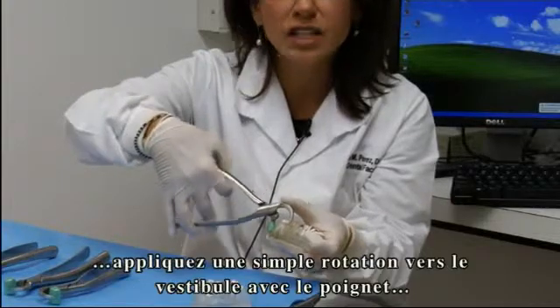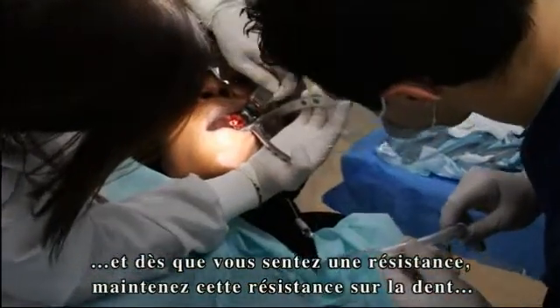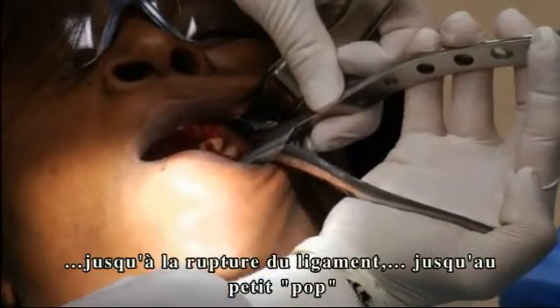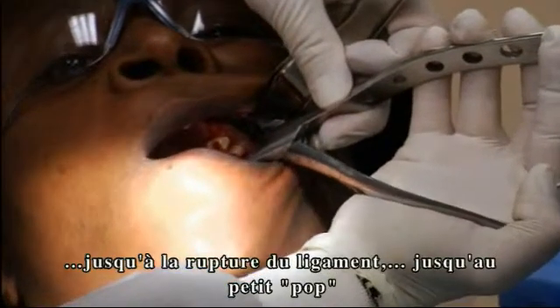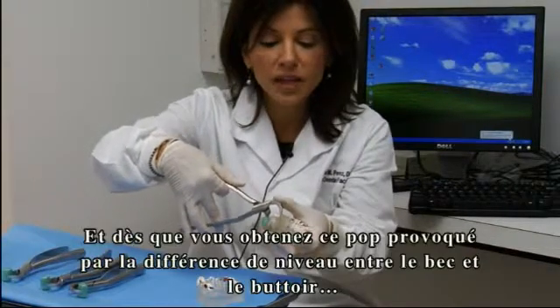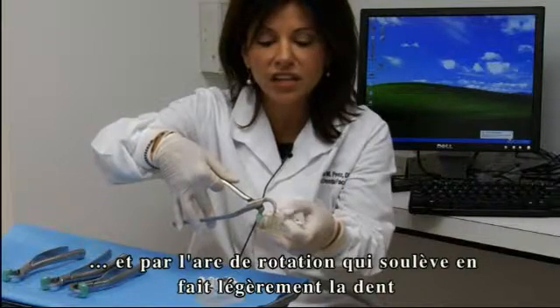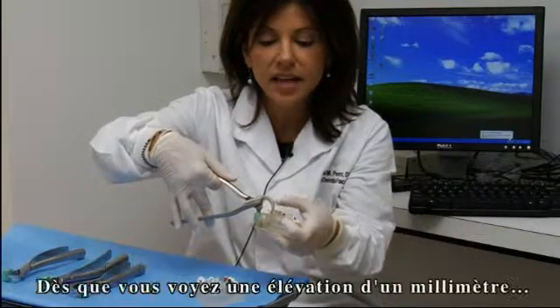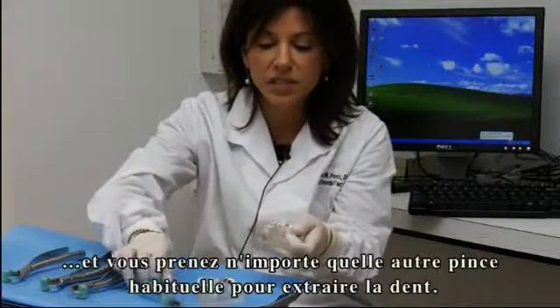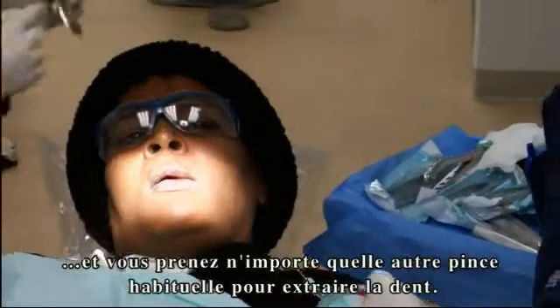Without squeezing the handles, a simple rotation towards the buccal is used with the wrist. As soon as you feel resistance, hold that resistance on the tooth, allowing the periodontal ligament to break down and the bone to expand. Continue to hold this resistance until you feel a little pop. Sometimes this can take anywhere from a few seconds to a couple of minutes, but when you get that pop, because of the placement of the beak and the bumper at different levels, you get an arc of rotation and the tooth actually elevates slightly up out of the socket. Once you see or feel this little lift — about a millimeter or so — stop with the physics forcep and use any type of pincer device such as a rangeur or a universal forcep to remove the tooth occlusally.